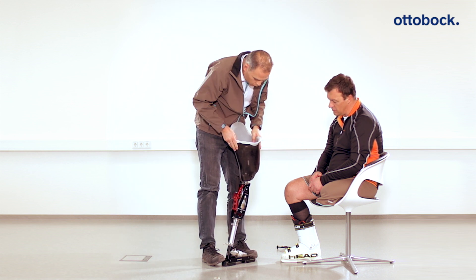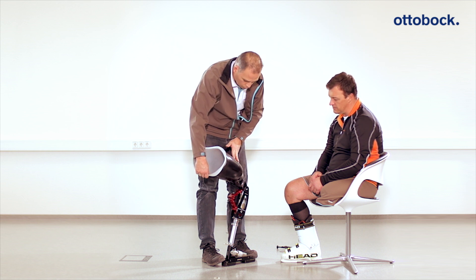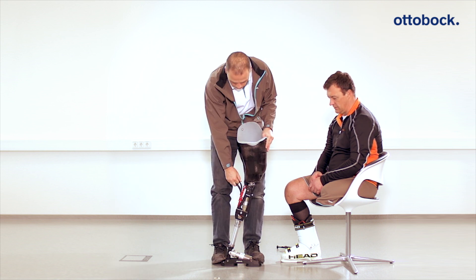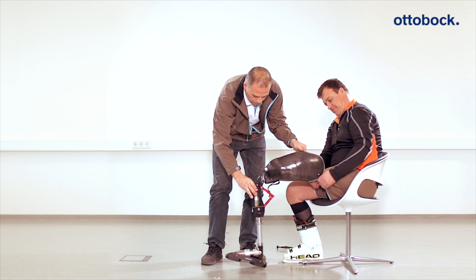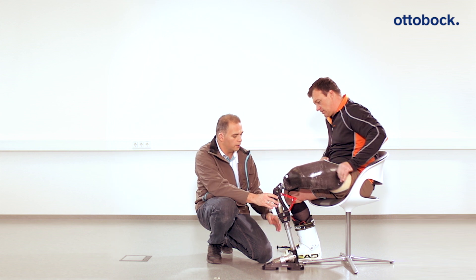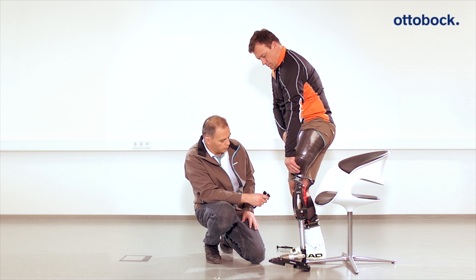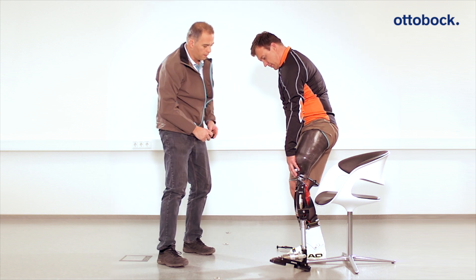Since the patient puts on the Pro-Carve prosthesis in its unlocked state while sitting down, it is necessary to ensure that the lock on the back of the knee joint is locked again in the extended position, which can be done with a simple hand movement. It is necessary to verify that the lock has been engaged securely. Feel free to support the patient the first time he or she stands up with the prosthesis.